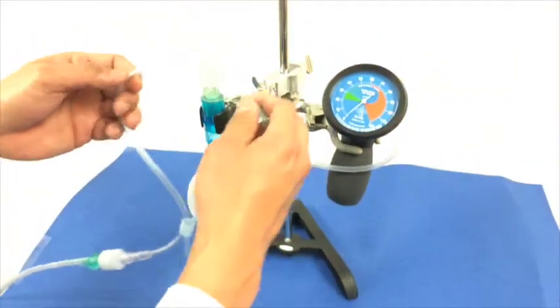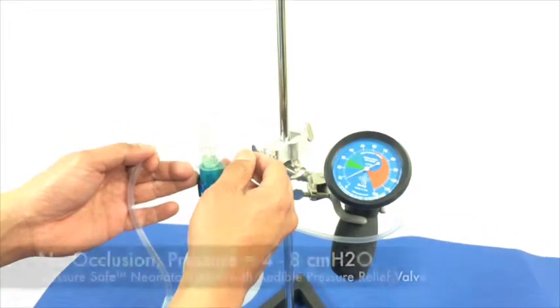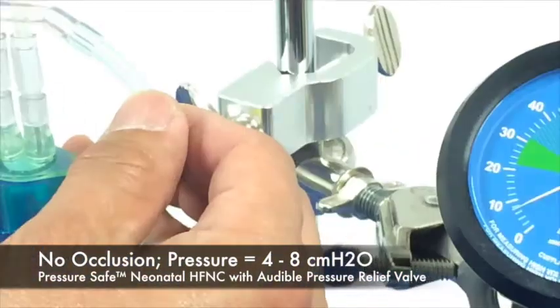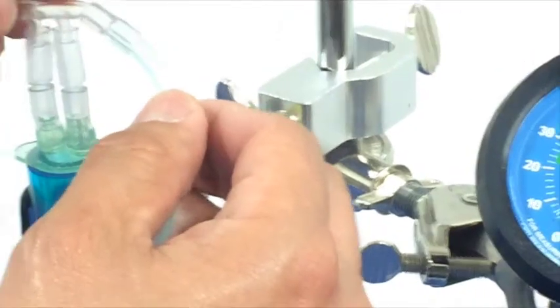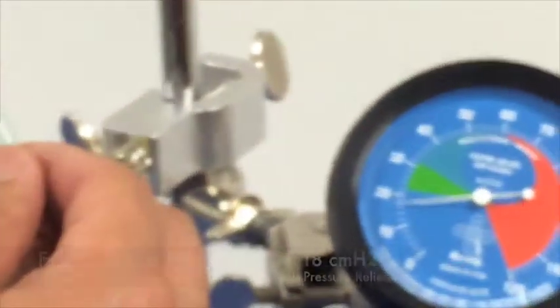The test is to determine what pressure is generated at standard application, where leak is present, when partial occlusion occurs, and when full occlusion occurs.